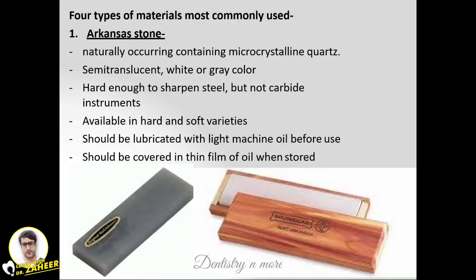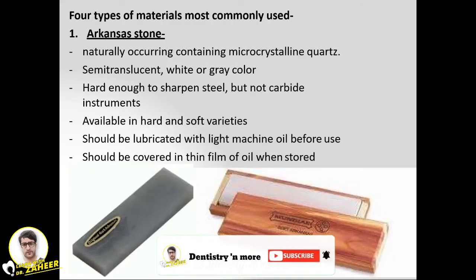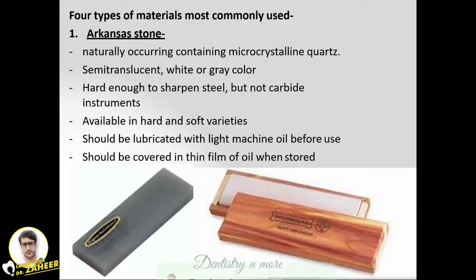There are four types of materials most commonly used. The first one is Arkansas stone, which is naturally occurring and contains microcrystalline quartz. It is semi-translucent white or gray in color, and hard enough to sharpen steel but not carbide instruments. It is available in hard and soft varieties. It should be lubricated with light machine oil before using, and should be covered in a thin film of oil when stored.